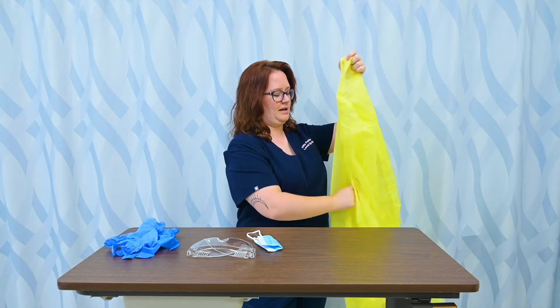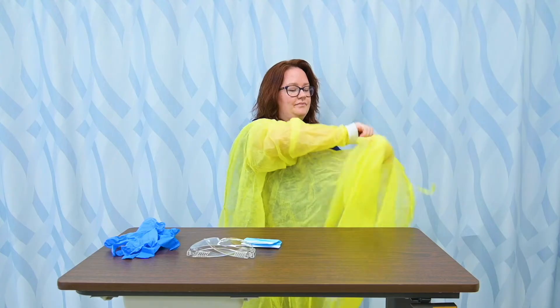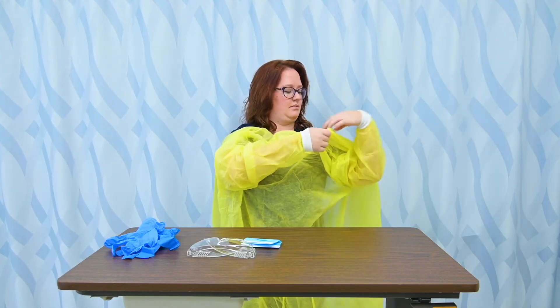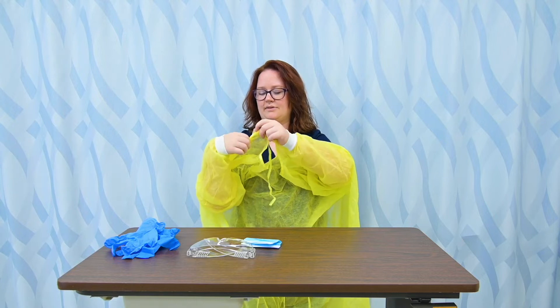I'm going to go ahead and slip my arms in and find my ties. This of course should be done before you enter your patient's room — if my patient is on any type of precautions, I need to be safe before I enter their space. I'm going to tie it in a bow, and then there are front ties as well to tie it around your waist.